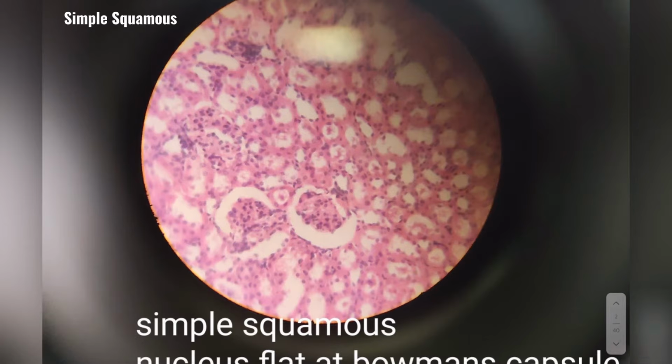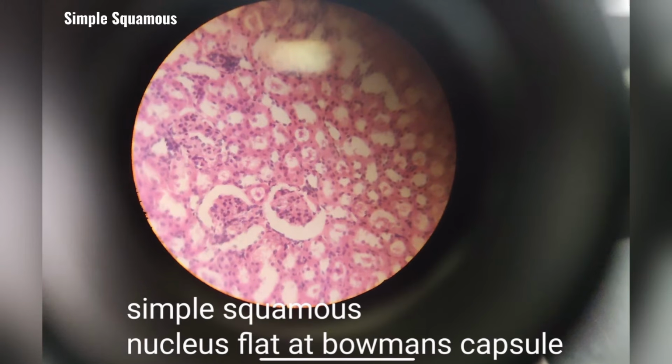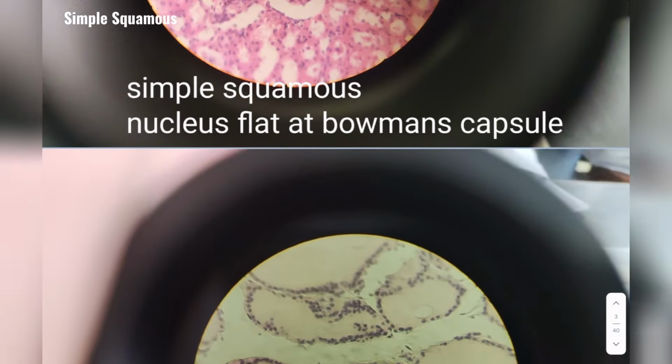So two things: the presence of spaces marks it as being either Bowman's capsule or alveoli, and you know that in Bowman's capsule and alveoli you have simple squamous epithelium. Microscopically, you can see that there are flat cells, and these flat cells are arranged in a single layer. You may not be able to see the cells. Look at the nucleus. You will find flat nucleus, and these flat nucleus are arranged in a single layer. This is simple squamous epithelium.